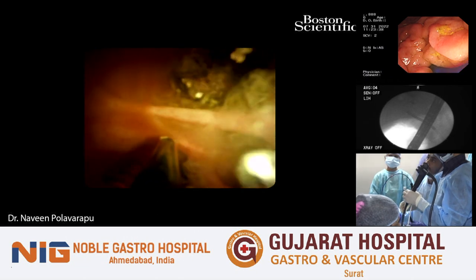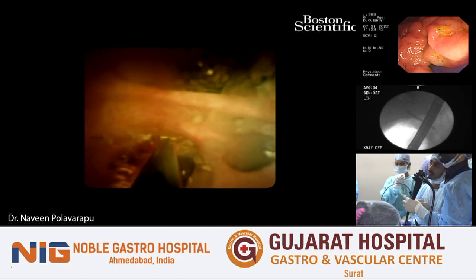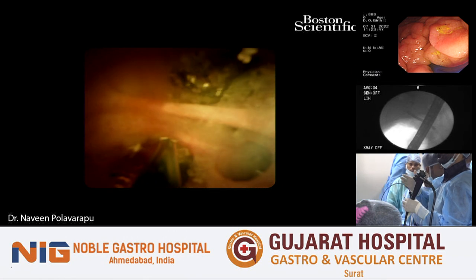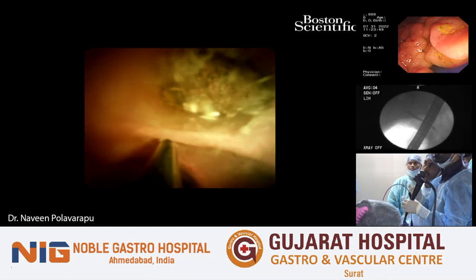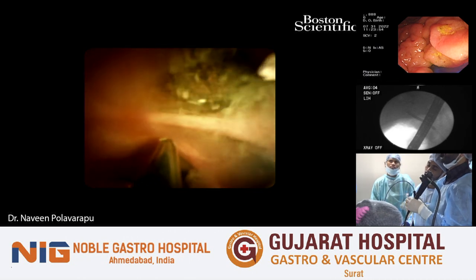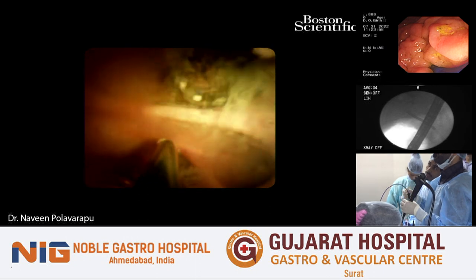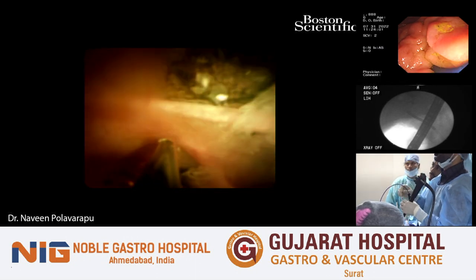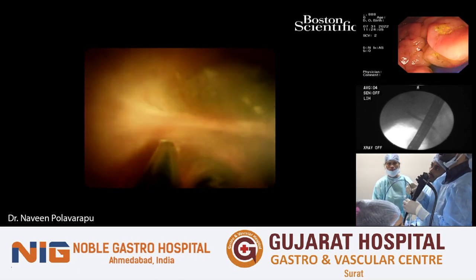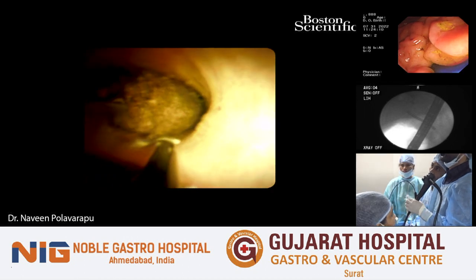Yeah. Two things which I tend to do. One is relax the bridge as much as possible. Be very close to the ampulla so that the acute bend is minimized. That's number one. Number two is sometimes if it doesn't work, you have no other choice of bringing the spy scope out into the ampulla and then feeding it. Getting the accessory to the edge of the spy scope, and then going in. So those are only two options that I feel. I don't know if any other experts have any other advices on it.